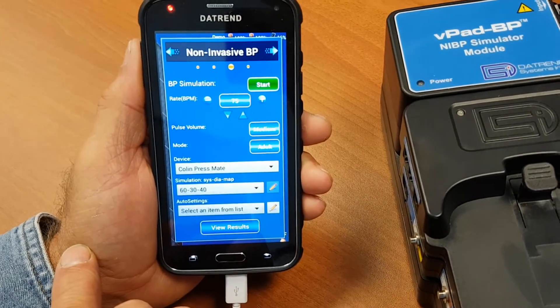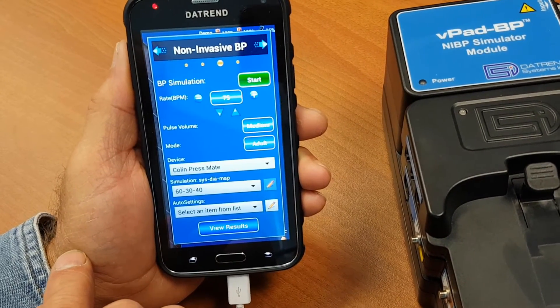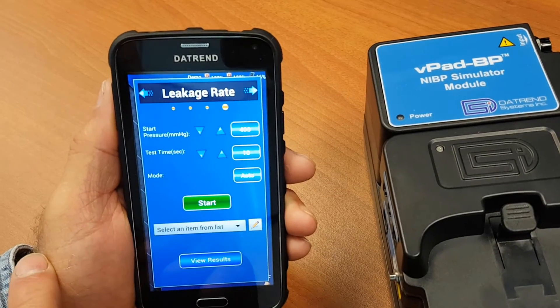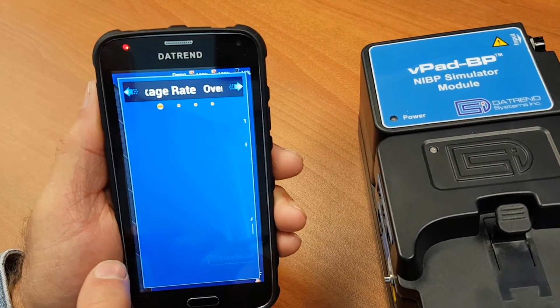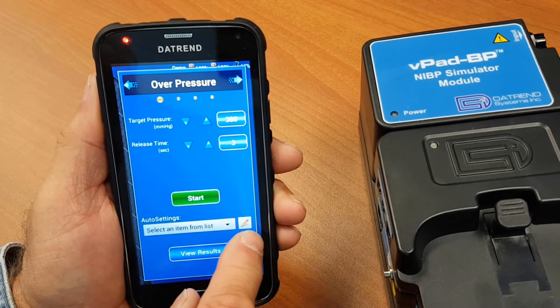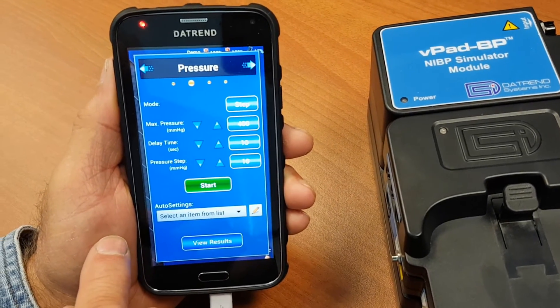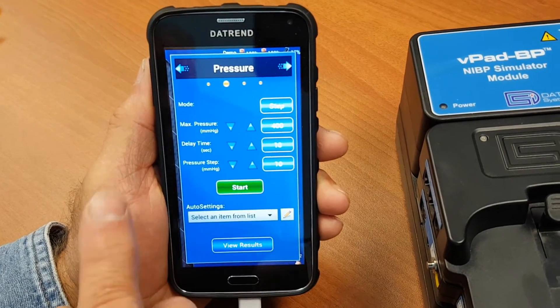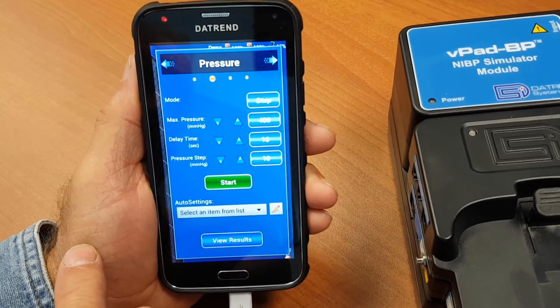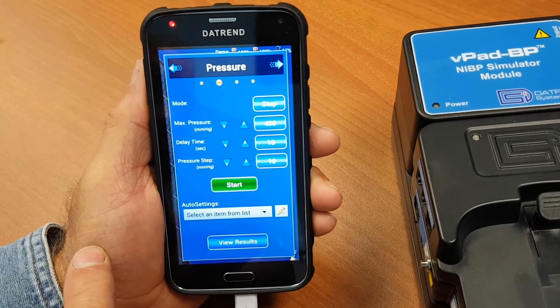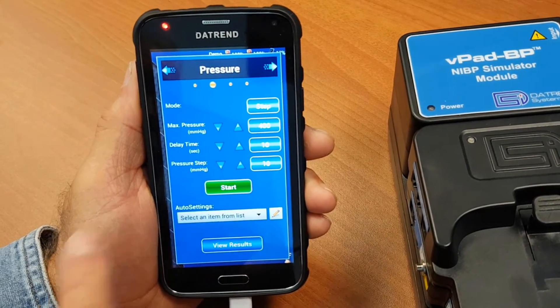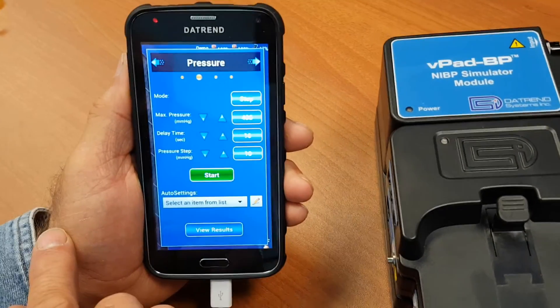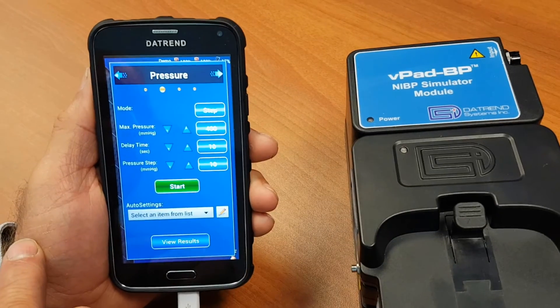In NIBP, there are a number of testing options: NIBP simulations, leakage rate tests, overpressure tests, and basic pressure tests. These can be run in an automated mode, a step mode (increasing or decreasing), or as a manual pressure test. From any of these modes, you can start the test, get the result, store the result, and then generate a test report file at the end.